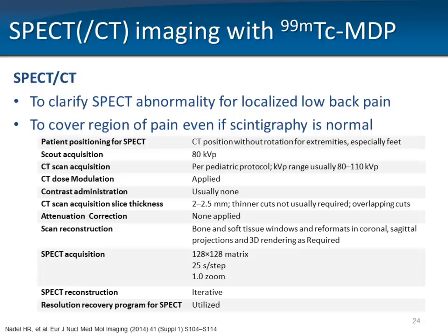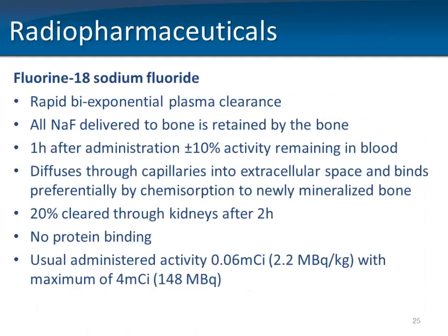And this is the protocol that was published quite recently, suggesting some CT settings that may be appropriate for the patient population. But again, this is not yet final. I believe we will see some changes to this. Keeping in mind, of course, that if you add CT to the study, you will add radiation exposure, but I will come back to that later.